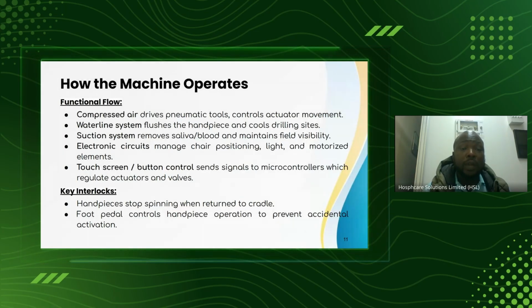There's a way you put a micro switch or a pressure switch. So if you lift the valve on a high vacuum suction nozzle, it comes on automatically. Otherwise, you can use internal suction, which only requires a compressor with a constant flow of pressure. The internal vacuum system will work perfectly.